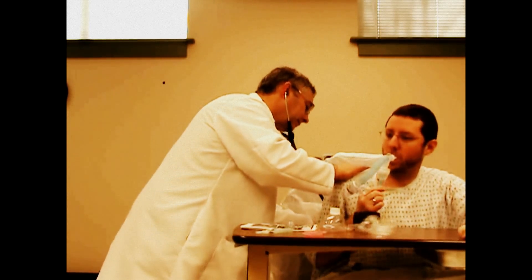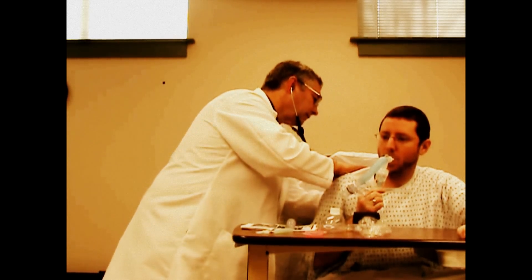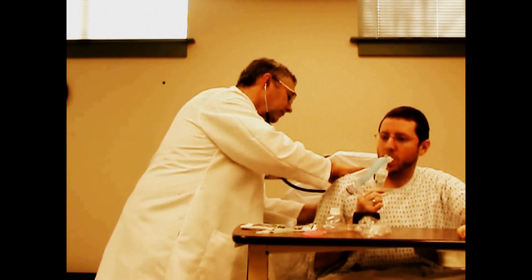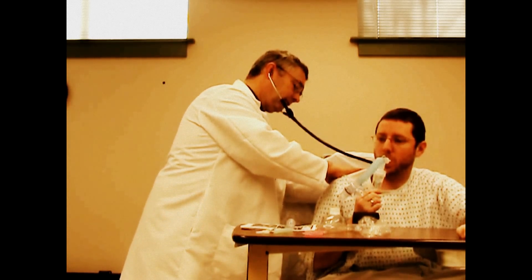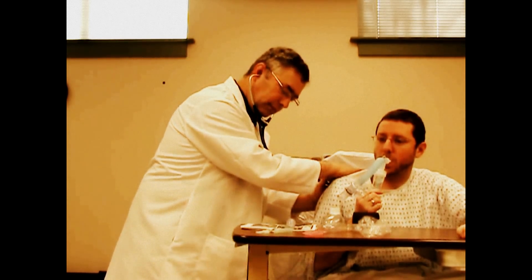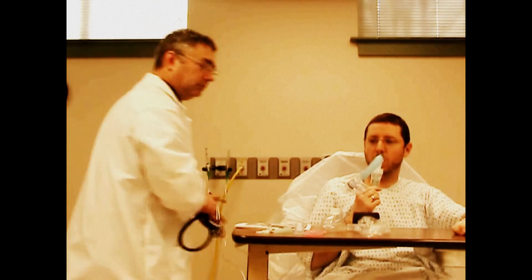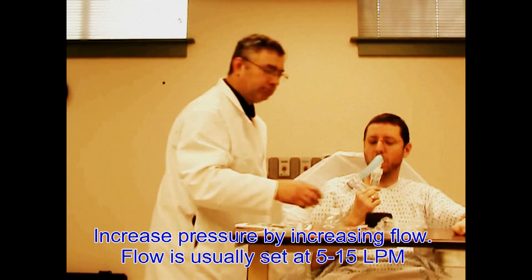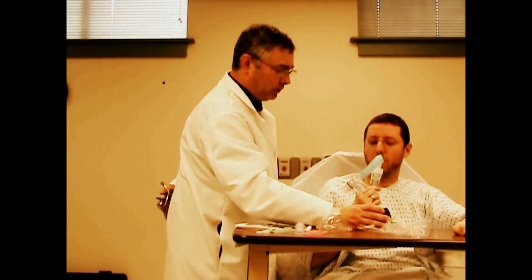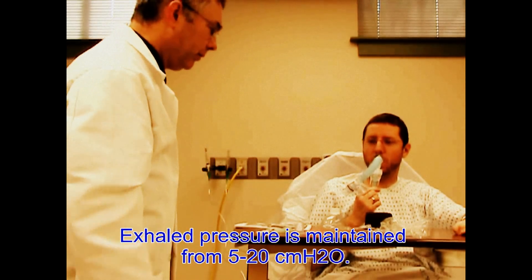You're doing that — move forward a little bit. I'm going to take a listen. I'm going to push the pressure up just a little bit more. Feel okay? Feel dizzy or a little discomfort anywhere?